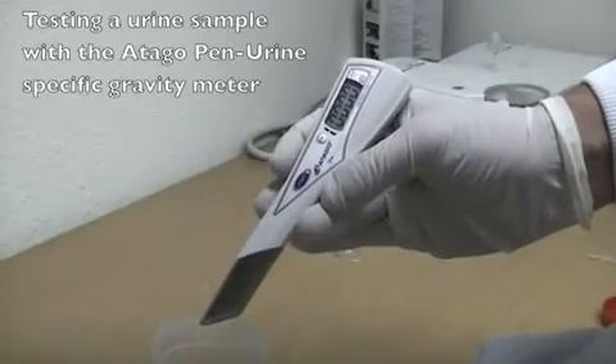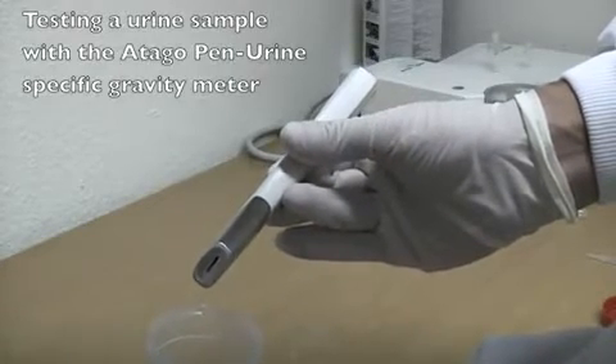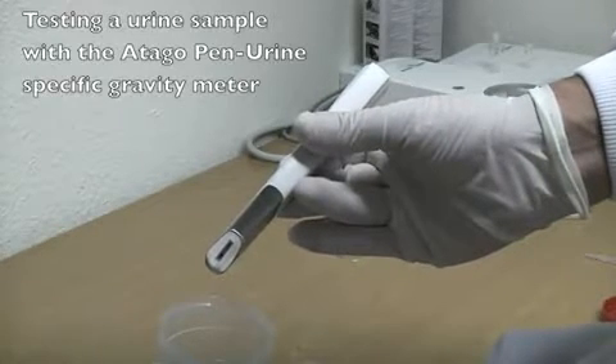The new Penn Urine specific gravity meters have a fully waterproof IP67 end fitting to allow the probe to be applied to the sample directly.